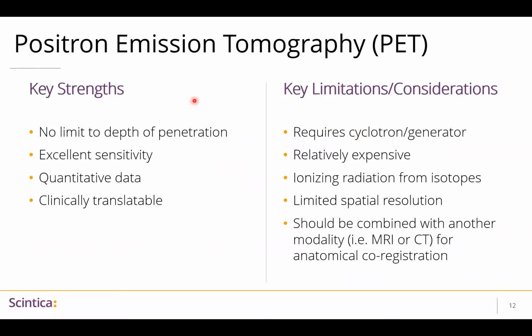So again, focusing on some of the strengths, there's again no limit of depth of penetration. There's excellent sensitivity. So when we're designing new contrast agents, we only need small quantities. The data is truly quantifiable and of course, clinically translatable. This is very commonly used in the clinic as well.